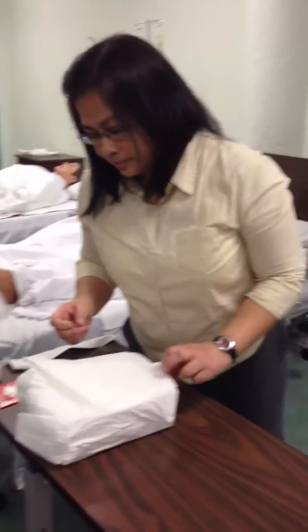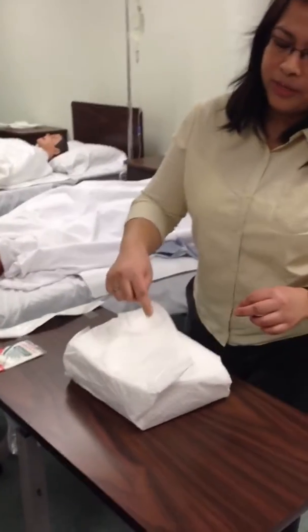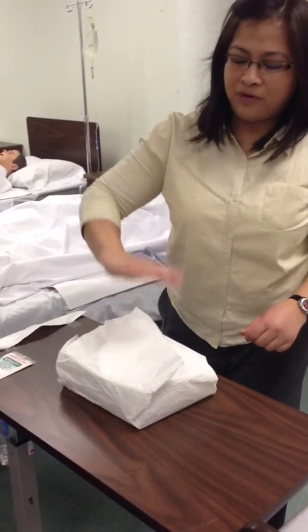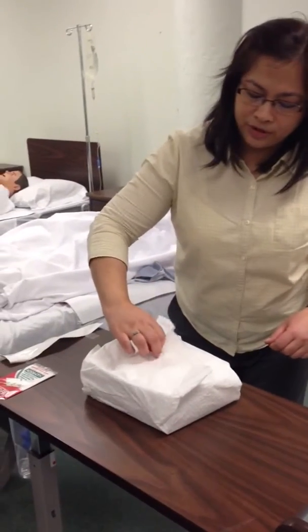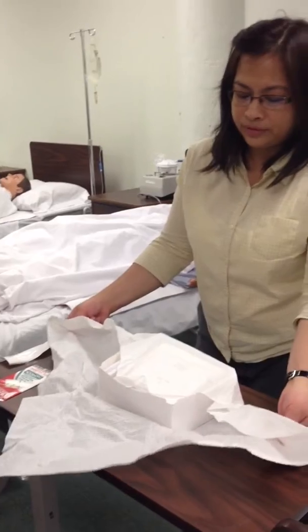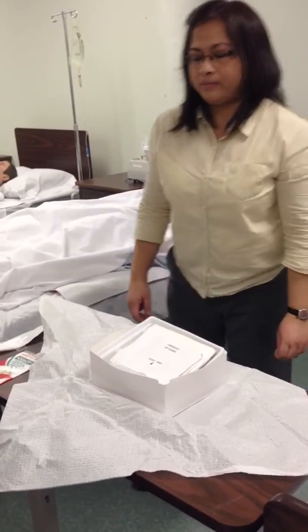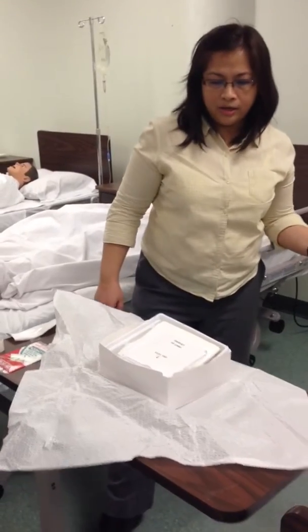Now you're gonna go over here. Let me see, because this one I think is okay. This flap has to be going away from you. I'm sorry. I'm not supposed to go like this, all right? The first flap has to be going away from you. So don't go like this. You pinch over here. So you don't go over it and contaminate it. It's a sterile field. Cannot go over the sterile field. And then you go like this. From there, you're gonna walk sideways to your sterile gloves.